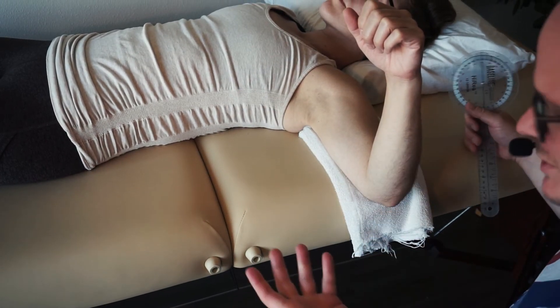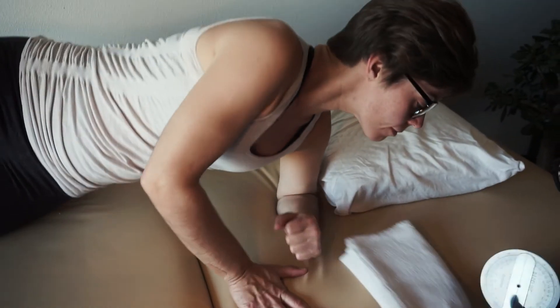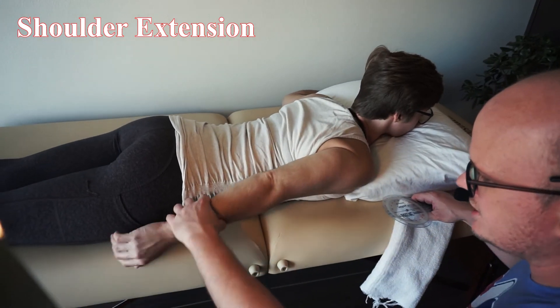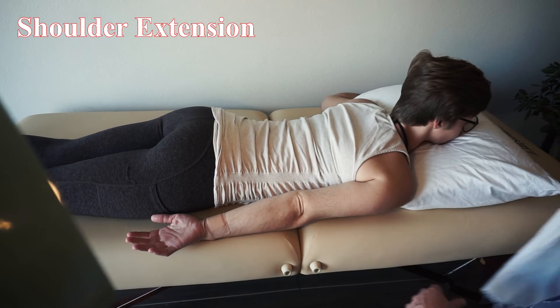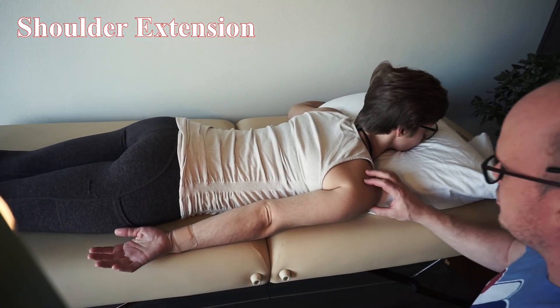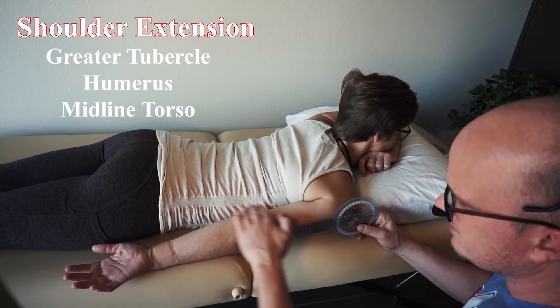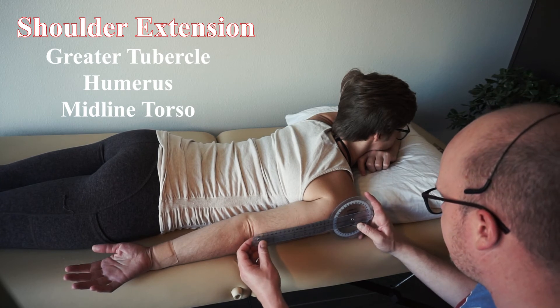Now she's going to get in the prone position and we'll do extension. Her arm is just going to be straight back laying beside her. You can put some towels in there if you want. Landmarks are just like we had with flexion — the greater tubercle, that laser going straight across. The other arms are going to bisect the body for the stationary arm and bisect the humerus for the moving arm.